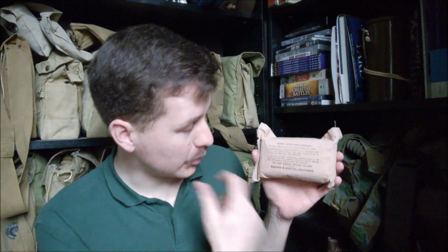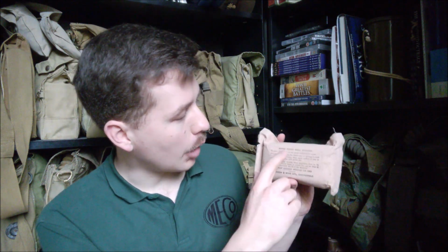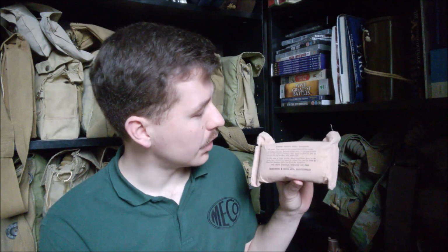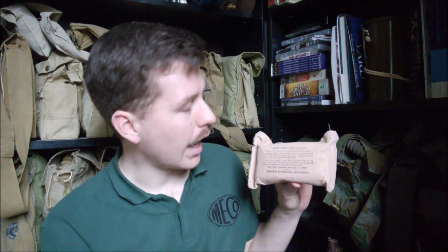And the packaging is very similar to the Joint Services dressing, which would replace them, in that it's just this outer peel open packaging is the waterproof layer, and the dressing is just inside. And you have Armed Forces shell dressing, so it's no longer specific Admiralty or Army contract. This is now being produced as a Joint Services dressing. It's for all three services, but it doesn't yet have that nomenclature.